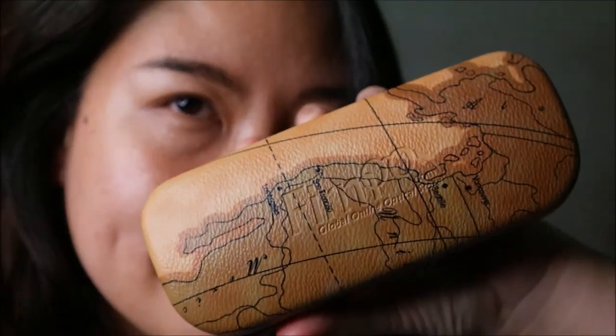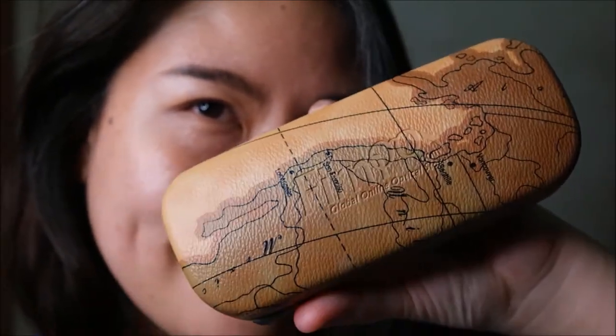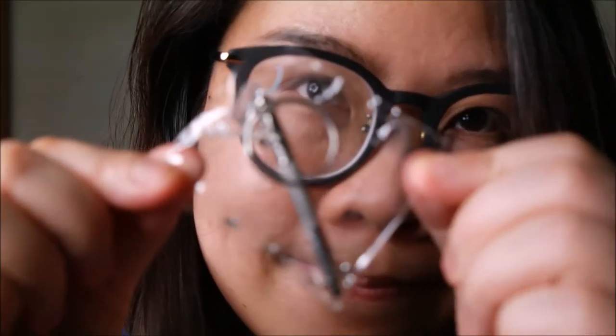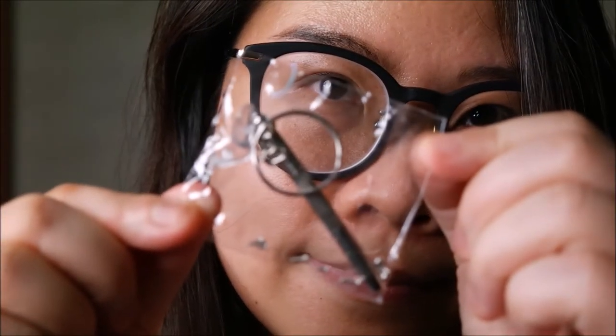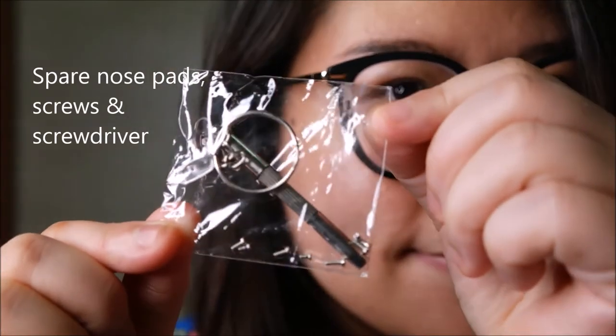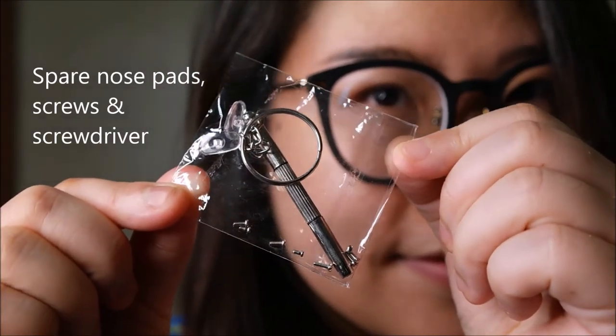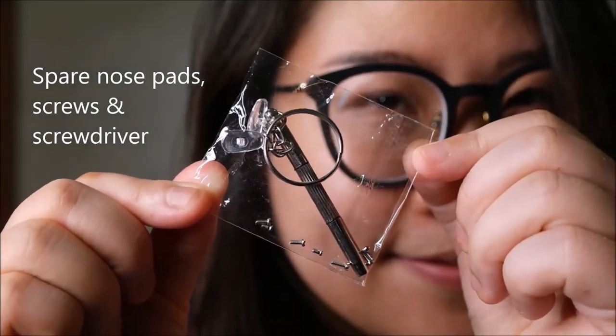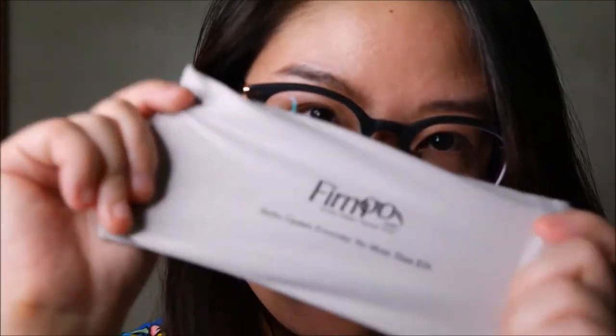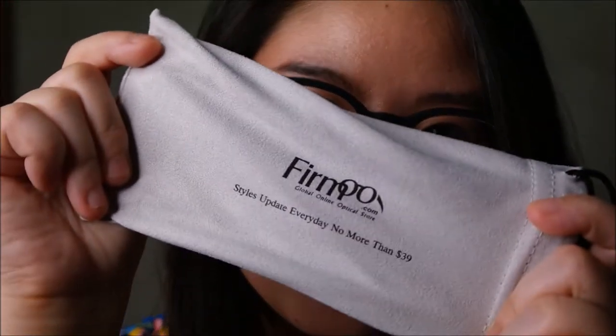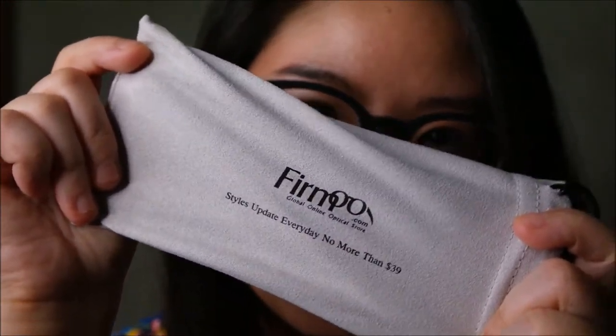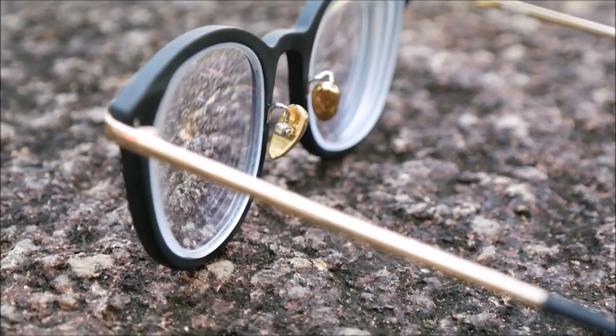The glasses come in this hard case and also this small little toolkit with spare nose pads and screws and double-ended screwdriver which is very handy just in case you need to make some small adjustments or change up some hardware. It also comes with this drawstring pouch in case you don't want to use the hard case.